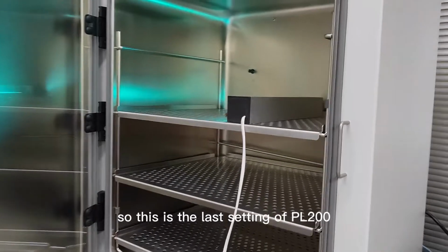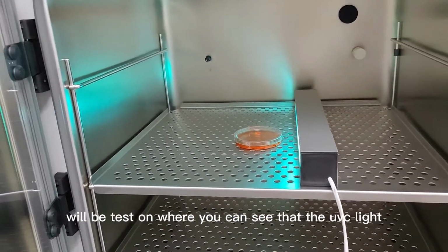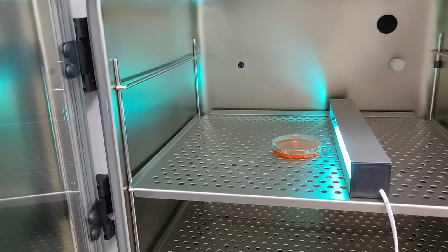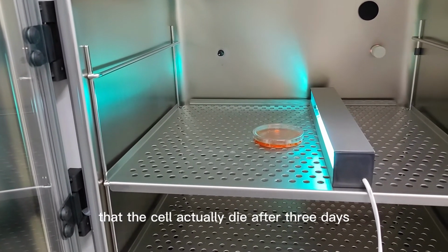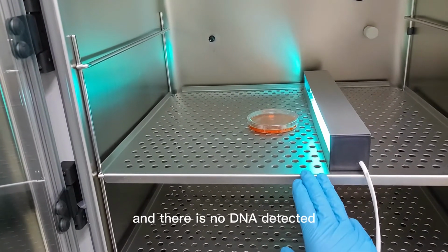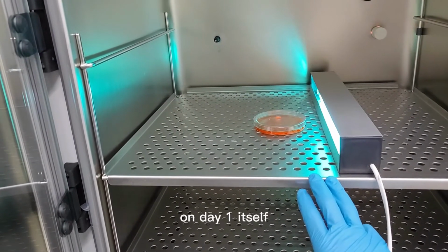This is the last setting of the PL200 that we tested, where you can see that the UVC light shines directly towards the cells for up to 3 days. The results show that the cells die after 3 days, and they start dying on the first day itself. There is no DNA detected after 3 days, and the DNA starts to degrade on day 1 itself.